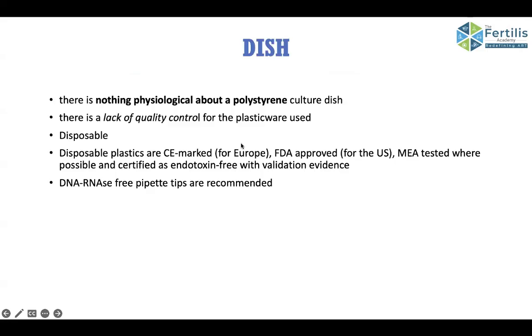If you talk about the dish, it's a plastic polystyrene dish. It is said that there is nothing physiological about the culture dish. And there is a lack of plastic quality control in the plasticware we are using. It's disposable, and the disposable plastics are characteristically CE marked for Europe and FDA marked for USA. Preferably, they should be MEA tested where possible and endotoxin free with validated clinical evidence.